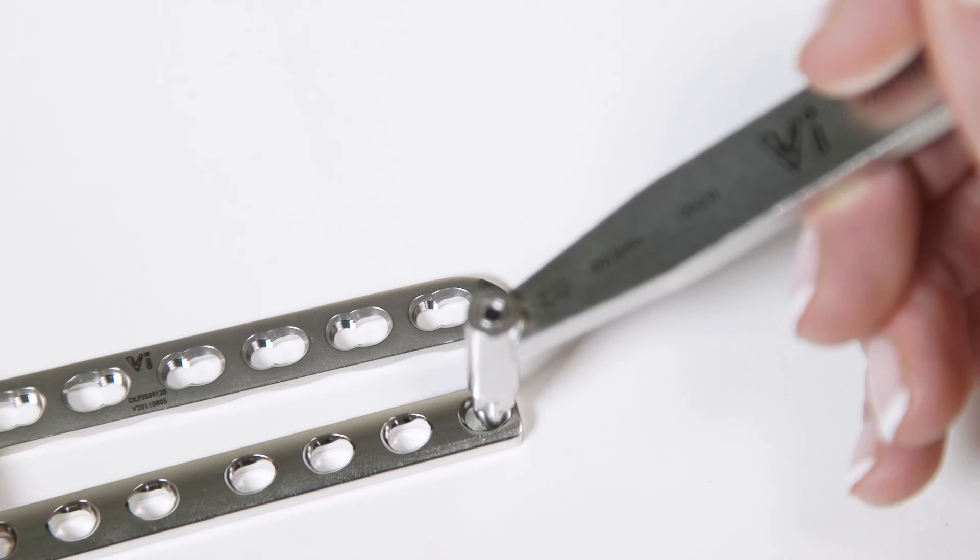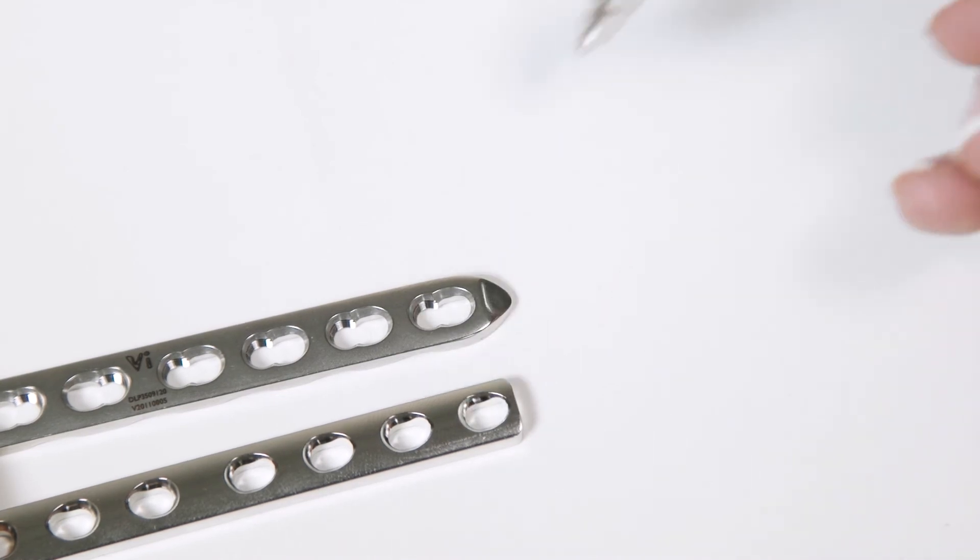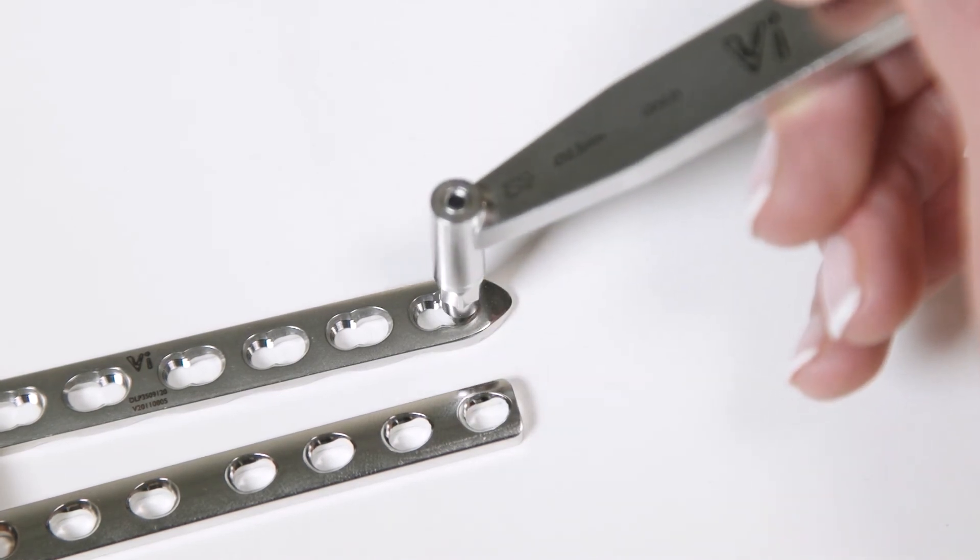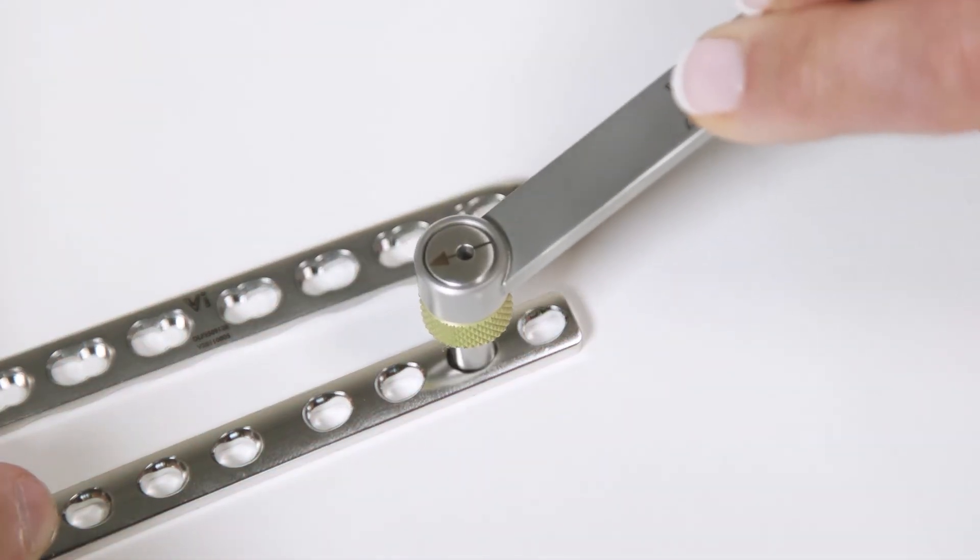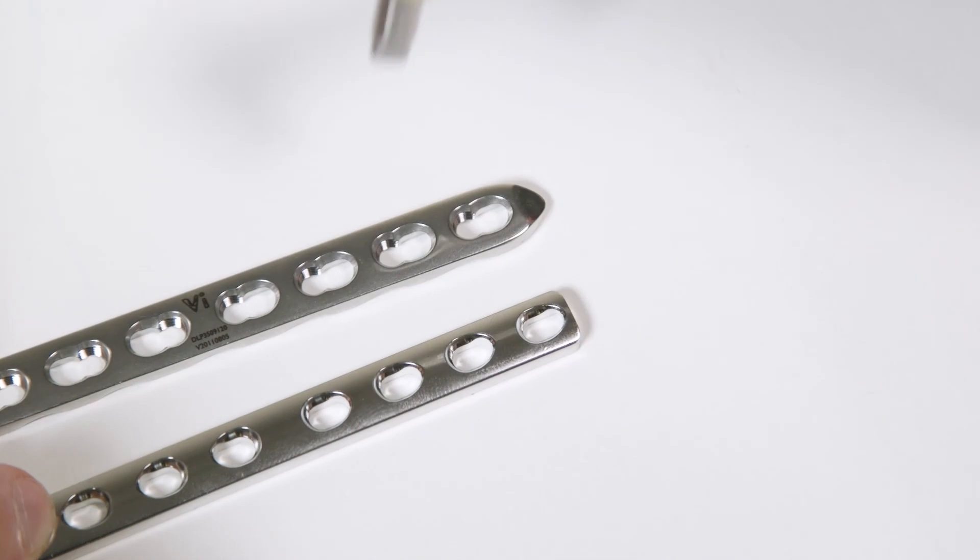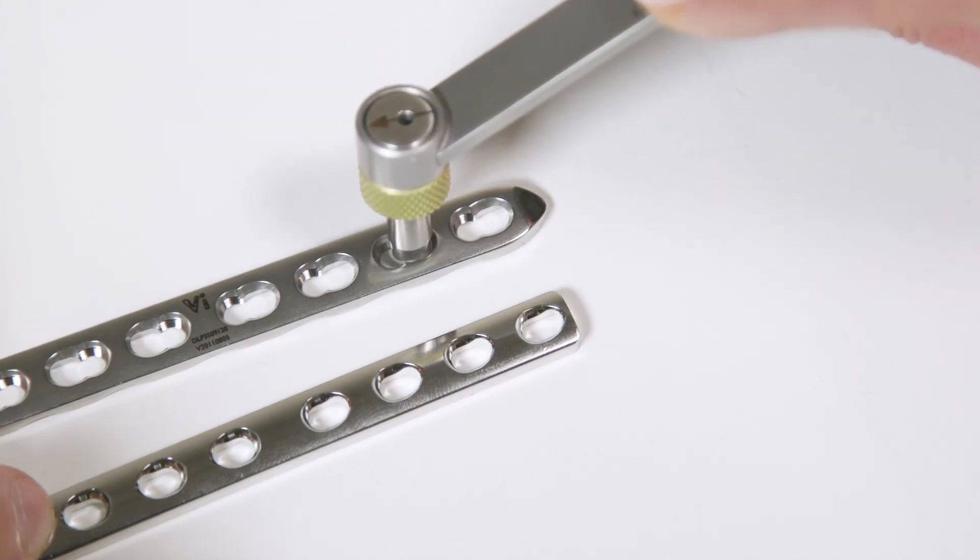Remember, a Universal Drill Guide can be used in either a DCP or a DLP. The Load Neutral Drill Guide can only be used in a DCP. The tip of the device will not fit into the combi hole of a DLP.